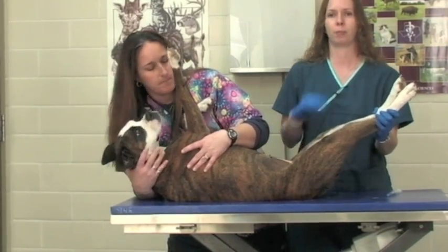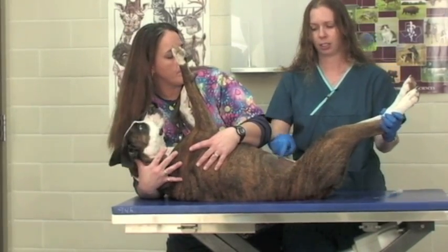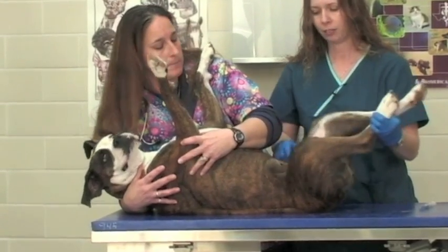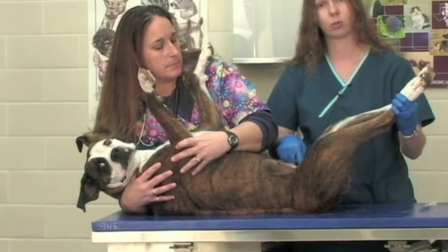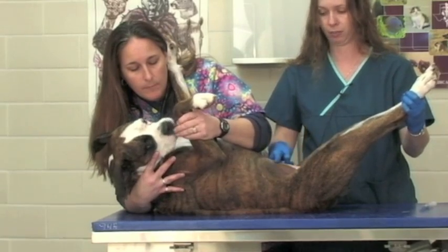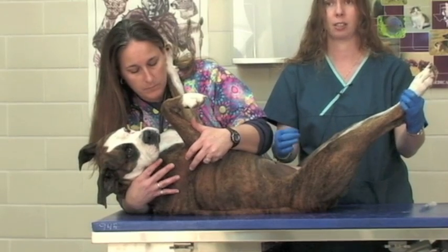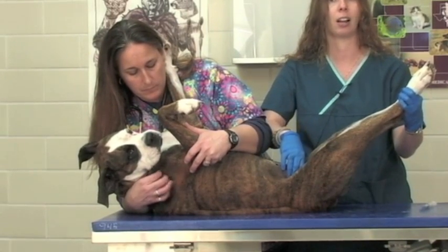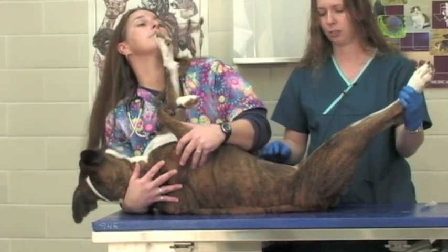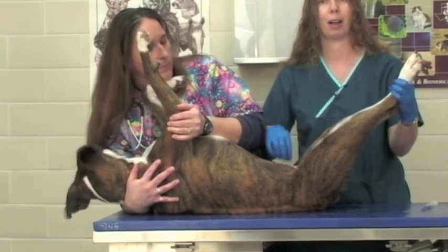There are two rules of thumb that we like to follow here at the Vet School. The first rule of thumb is if you take a look at the last four mammae on your patient's abdomen — and this is true for male dogs and female dogs — and if you draw an X between those four mammae, they generally cross about two-thirds of the way back between the first set and the second set. That is a good landmark to use to place your needle into your patient's bladder, because the bladder is usually going to lie directly below that area. The second rule of thumb is if you place a little bit of alcohol on your patient's abdomen, it will generally pool right over where the bladder is.